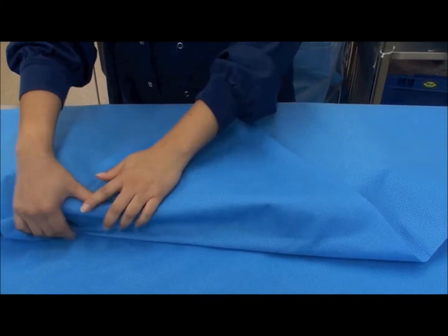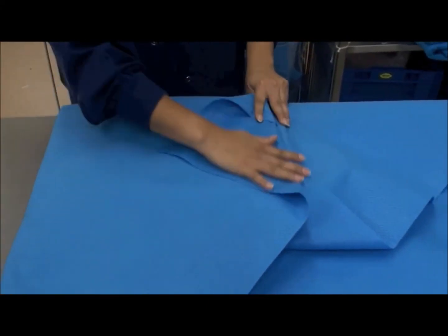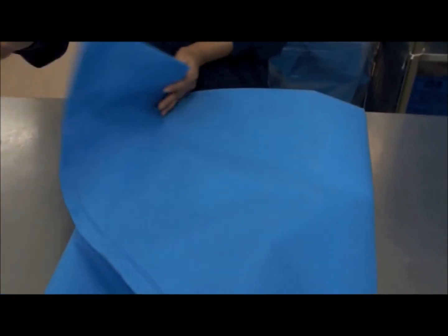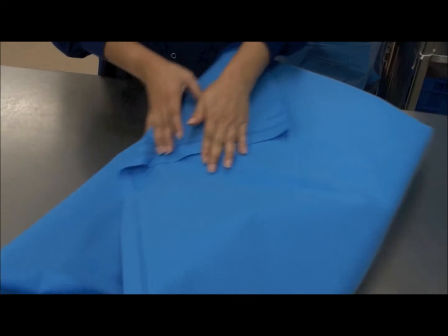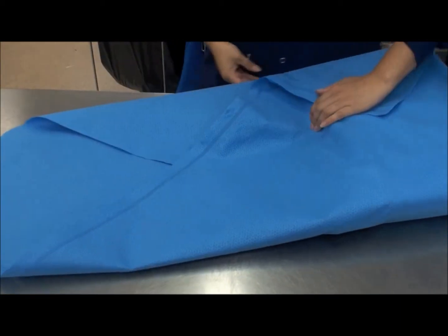The surgical instrument tray is wrapped using one of the methods of wrapping. The method used here is the envelope style, which is a standard technique as described in standard AS4187.